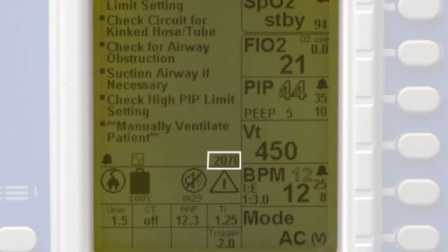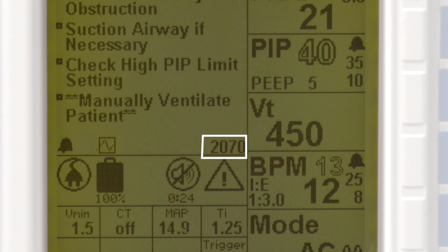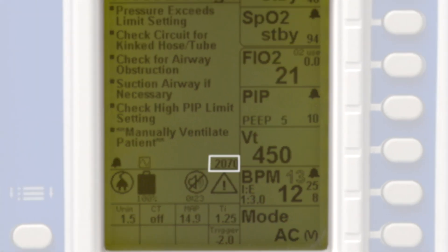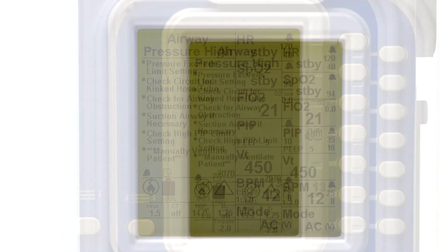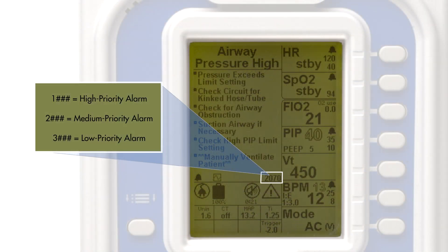On the right side of that same row is the alarm service code. Each alarm has an associated four-digit code that helps the user identify the specific alarm. Each code begins with the number 1, 2, or 3, designating the severity of the alarm.